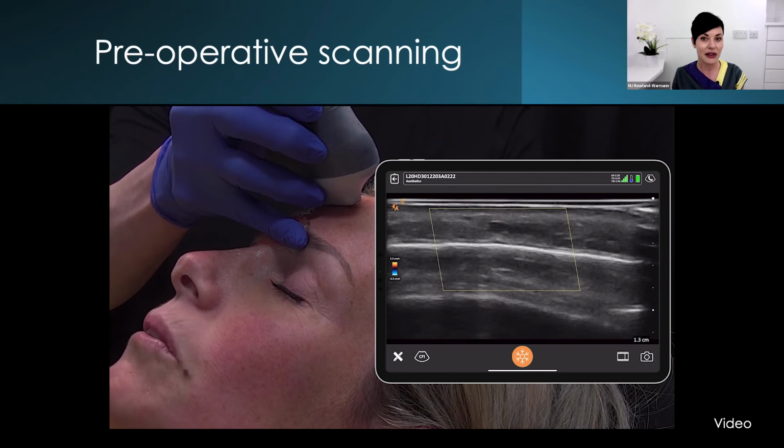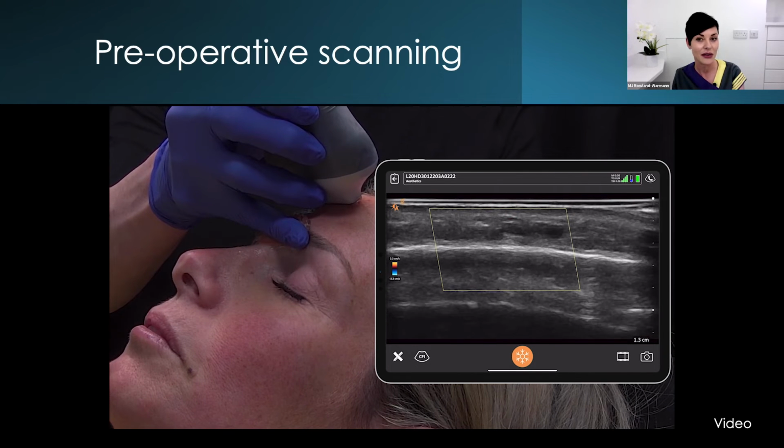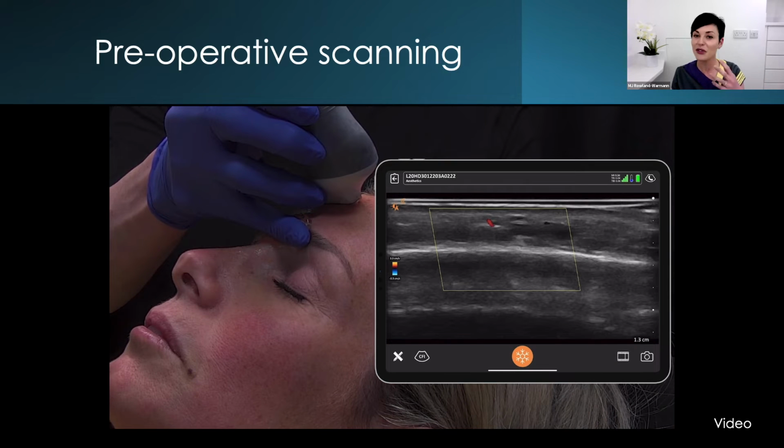As described by Schelke in the 2019 study I shared earlier, filler can irritate vessels. This can result in edema and pain because in the forehead, there's no room to expand. And a further worrying consequence might actually have been activation of choke anastomoses, which can lead to ischemia of the forehead. This can be due to irritation by filler and cause serious perfusion problems. So seeing filler this close to the vessel is really worrying.